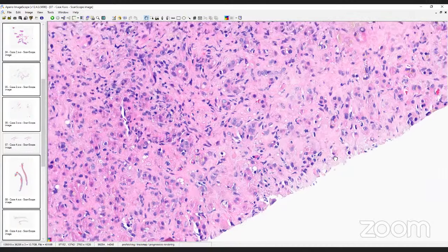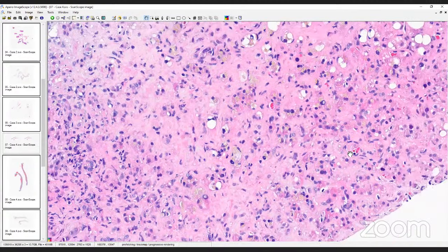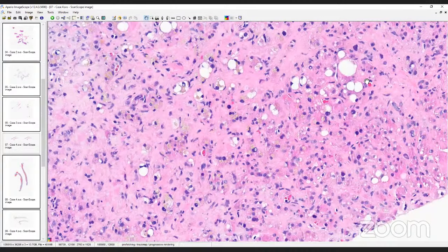So when I started looking, I saw a few of those, not too many. And then you also have something like this. It's not exactly a signet ring cell, but it's a tiny little blood vessel that is trying to form itself. It's another signet ring cell. So these signet ring cells are pretty characteristic of epithelioid hemangioendothelioma. The difference from a signet ring adenocarcinoma is that these contain red blood cells as opposed to mucin droplets. And the stain that one would do for this is a marker for endothelial cells.